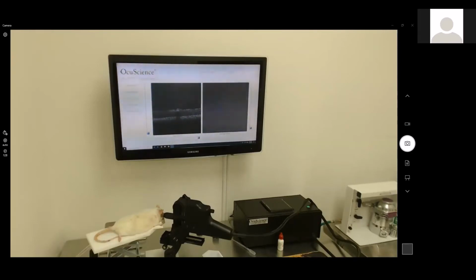You have to do it enough times to really get a feel for where your position is and that you can capture a nice solid block of data. Okay, so that's basically OCT on 2D and 3D. So that's all of our capture capability.